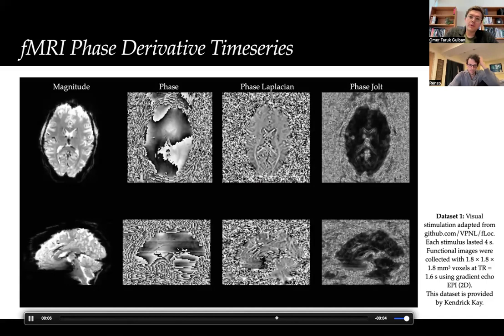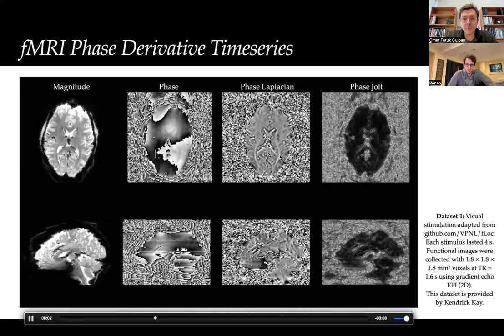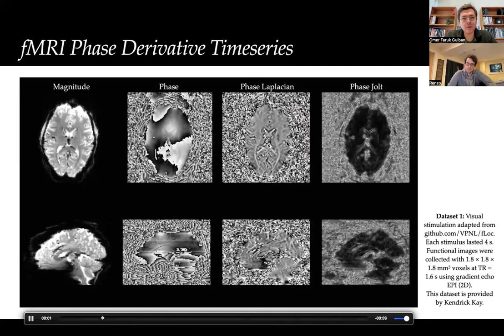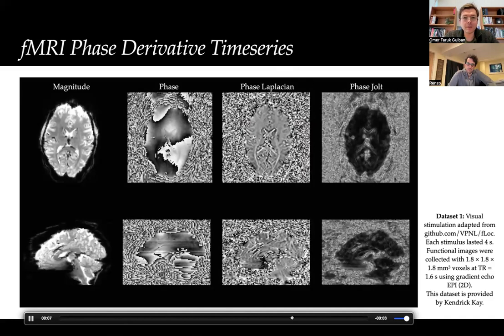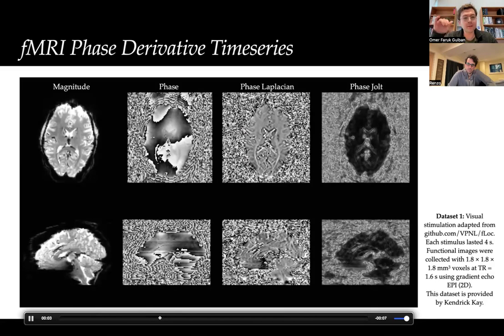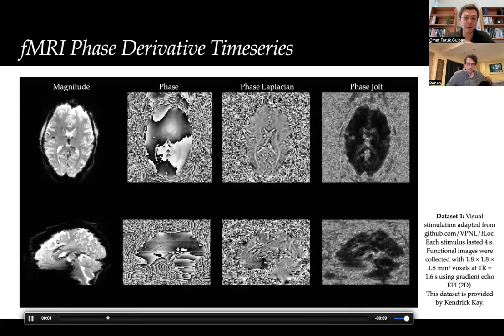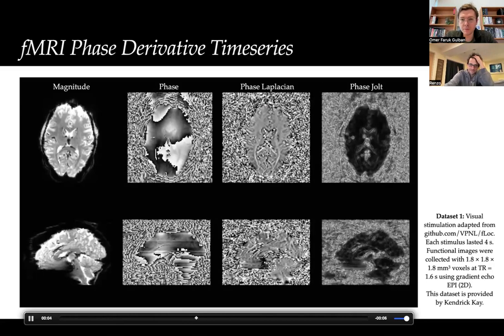And what it means to compute the volume-wise Laplacian of the time series. If I understand correctly, this is what they are looking at in this ISMRM abstract when they are talking about this new method. They compute essentially the Laplacian of the phase, that is this guy, and they scale the Laplacian with different numbers based on the tissue modalities, like white matter versus gray matter are scaled differently and so forth. Hopefully I'm correct on this, if I understand their previous paper correctly.